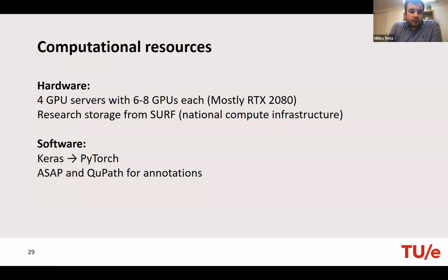In software, traditionally we used Keras. For my PhD work, I used MATLAB, but at some point in 2014, I was using the Caffe library, if you remember, for deep learning within MATLAB. That was really a long time ago, 8 years now, I guess. Then we used Keras, and now I push people to use PyTorch more, for the reasons that were, I think, also just mentioned in the chat. Now there's a nice ecosystem of state-of-the-art methods from the computer vision field that are available mostly in PyTorch.